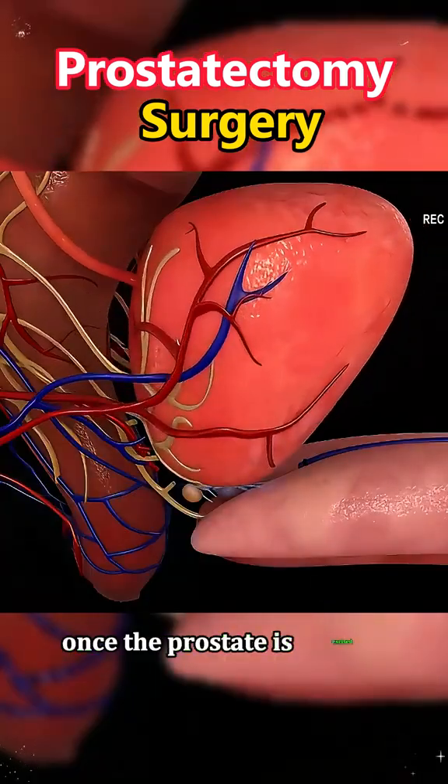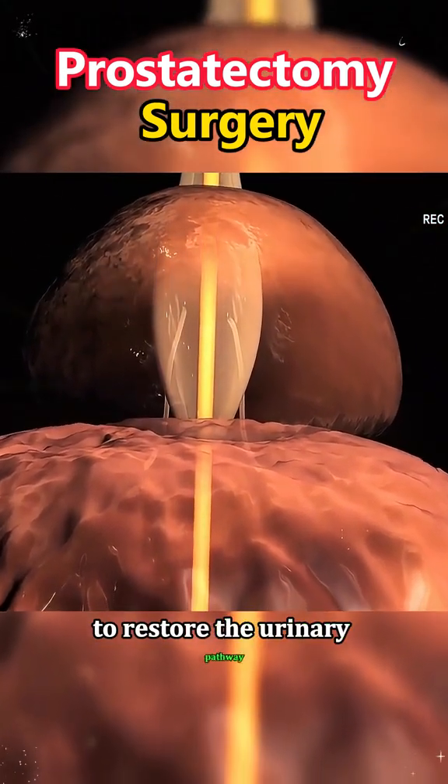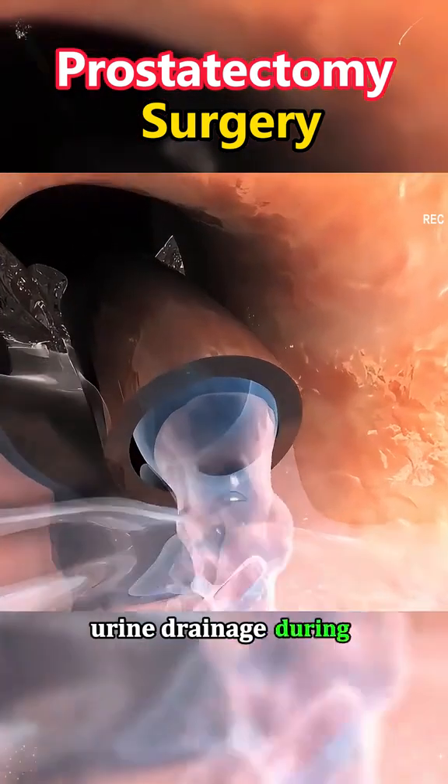Once the prostate is excised, the urethra is reconnected to the bladder to restore the urinary pathway. A catheter is placed to aid in healing and allow urine drainage during recovery.